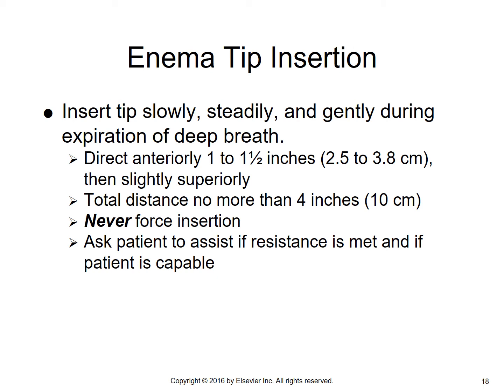The other thing that's of great importance when you're inserting an enema tip is you never force insertion. You may go to put the enema tip in and you feel a lot of resistance. It's just not going in. At that point in time, you stop. You don't force an enema tip in. Now, you may ask the patient, as it says here, to assist. They can put it in because they're just clamping down. But if you're inserting it, there's resistance, and the patient still can't insert it him or herself, then you let the radiologist know.